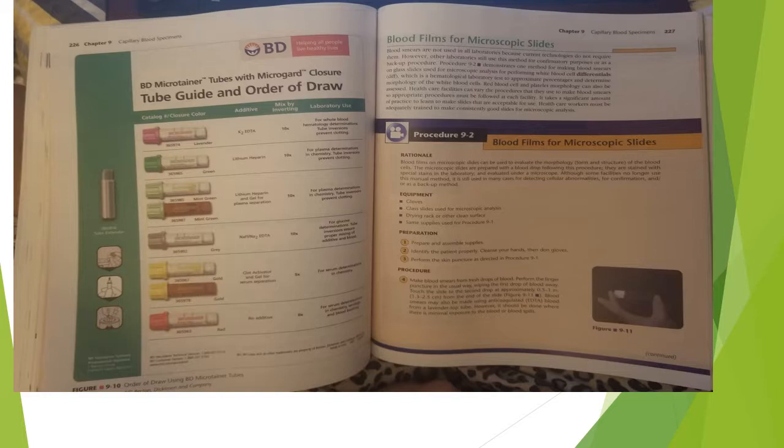Procedure 9.2 demonstrates one method for making blood smears on glass slides used for microscopic analysis for performing white blood cell differentials, which is a hematological laboratory test to approximate percentages and determine morphology of the white blood cells. Red blood cell and platelet morphology can also be assessed.